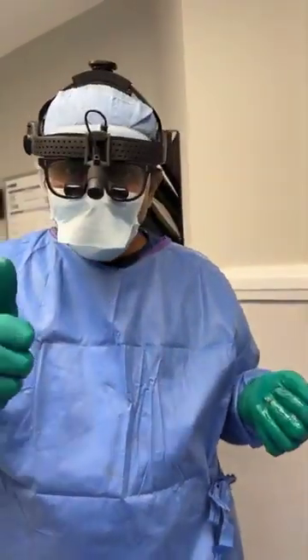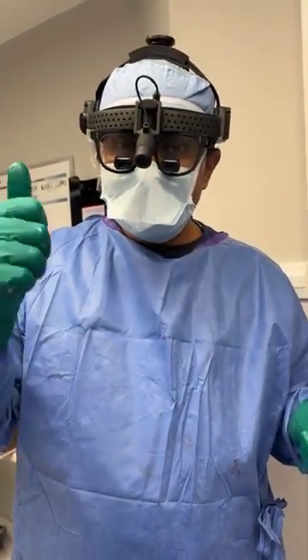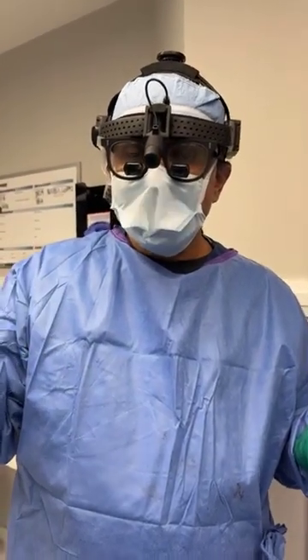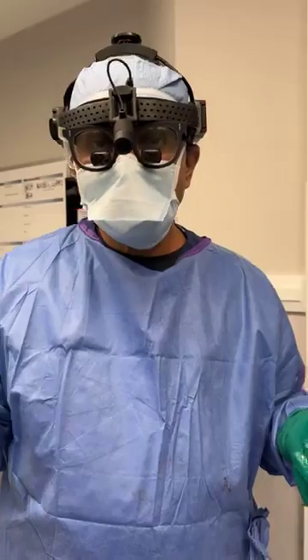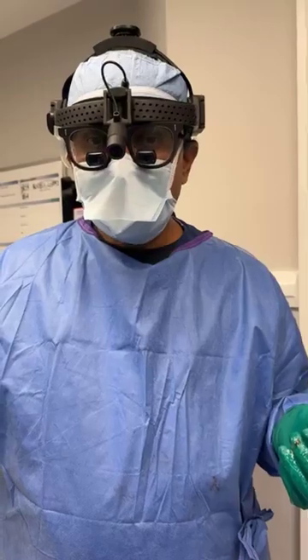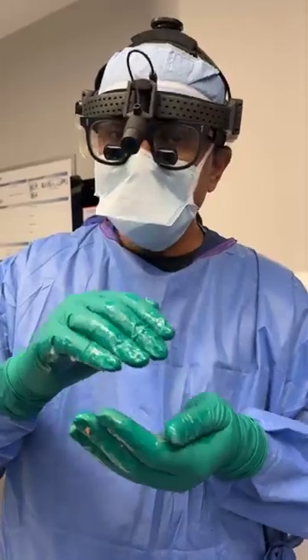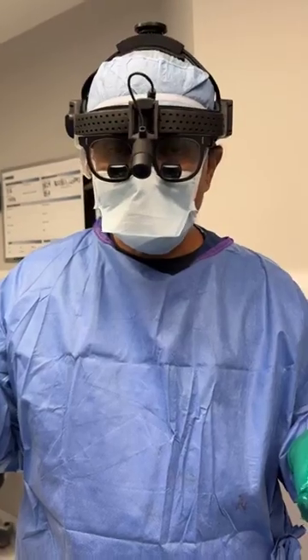So there you have it, en bloc, the gold standard, no other better way than this. This lady is going to have an aesthetic flat chest closure, no need for drains, complete removal in the manner that you see. And this is what I would say, 20 years from now, I cannot imagine anyone else doing the surgery any better, as far as removing the whole implant capsule, all inflamed tissue, all Ethibond, all surgical clips, no matter what the inflammation is.